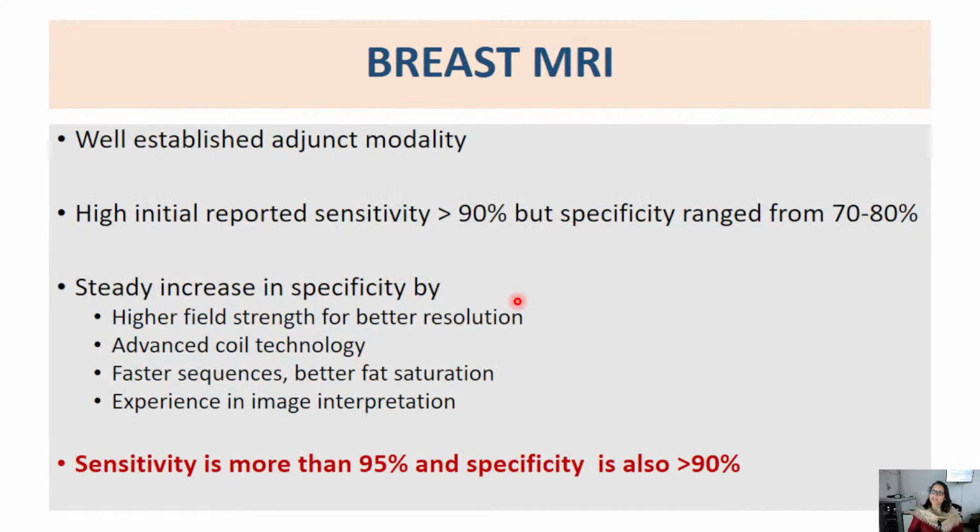Breast MRI is now a well-established adjunct modality in the evaluation of not only diagnostic features of breast masses, but also in follow-up of these cases who have received neoadjuvant chemotherapy.